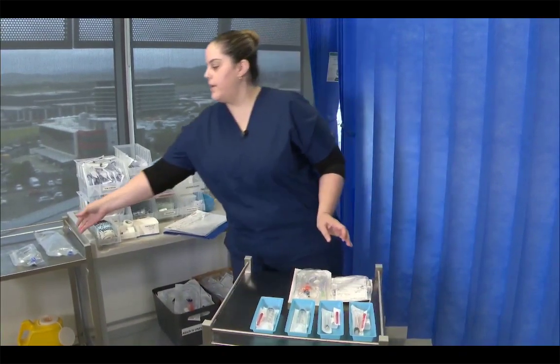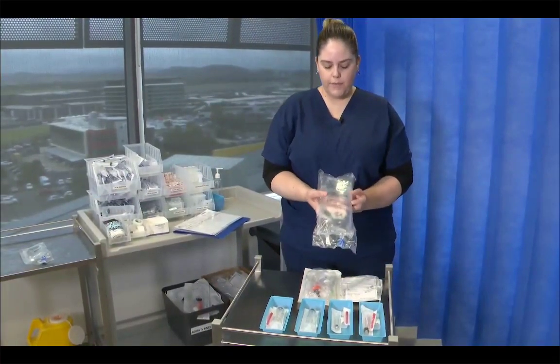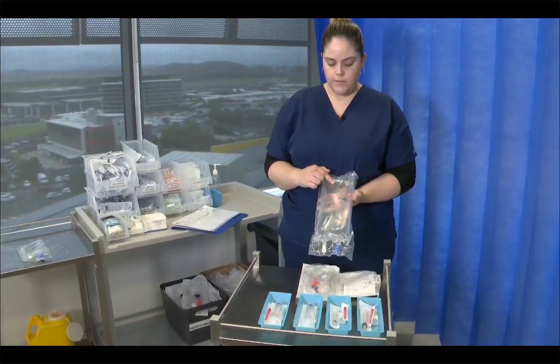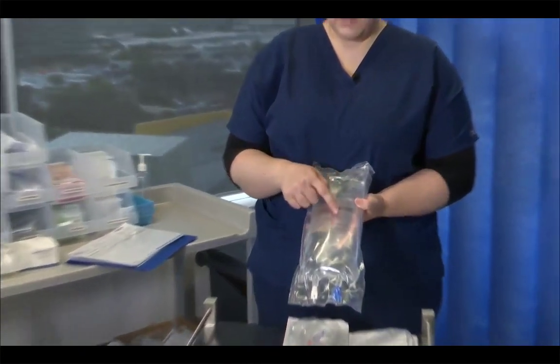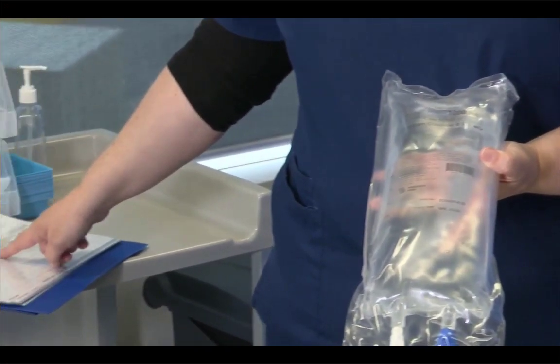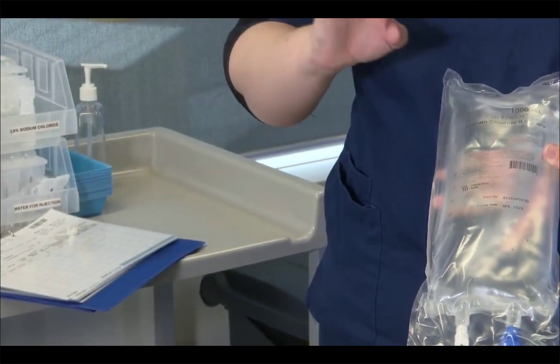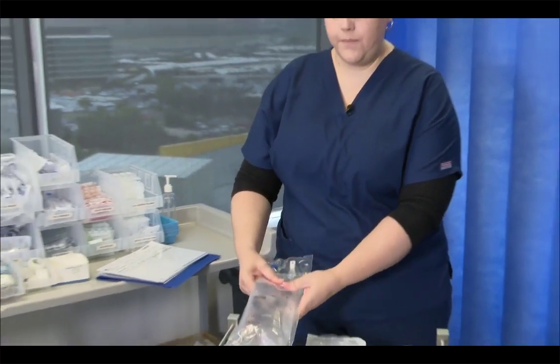At this time, looking at my order, I require sodium chloride 1000 mils to run with my PCA bag. So I'm going to gather a bag of sodium chloride, performing my first check at this stage. Sodium chloride 1000 mils, expires 2026, and my order is for sodium chloride 1000 mils to run at 50 mils per hour. So I'm happy that I've got the right thing. Again, that was performing my first check.